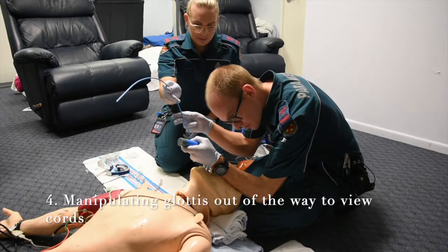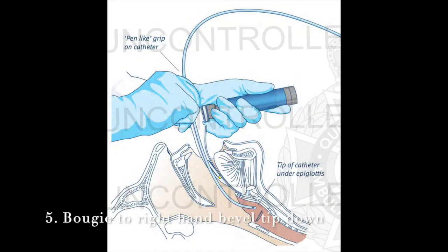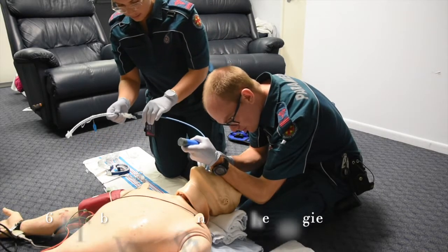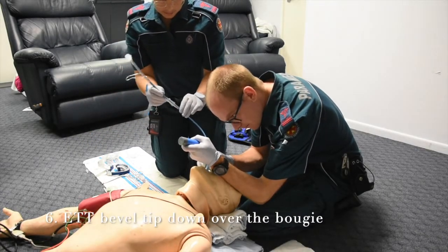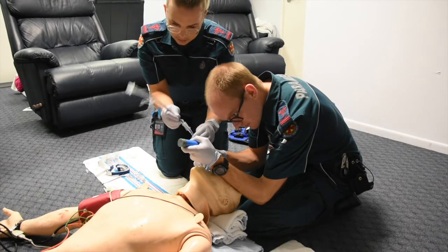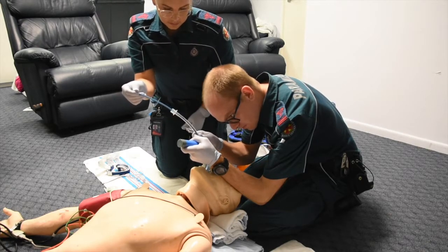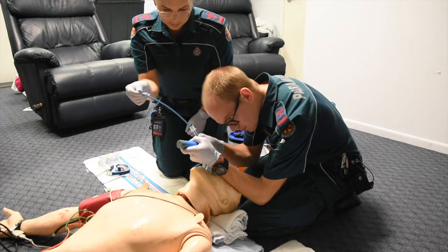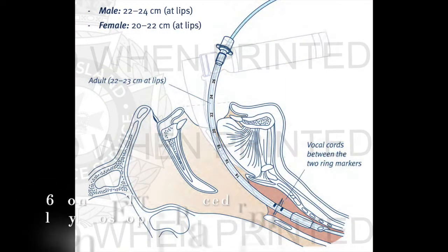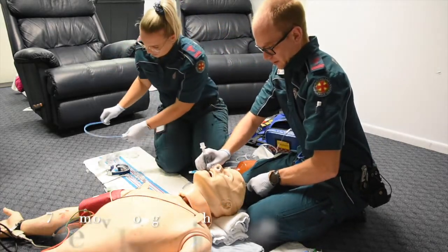Can I please have the bougie with my right hand, bevel tipped down? Okay, the bougie is through the chords. Alright, can I please have the tube over the bougie, please? Holding that in place, watching out for the teeth. If I was to find this difficult, I could always do some laryngeal manipulation. I have the tube, hold the bougie, tube through the chords, and that's 22 at the lips. Okay, remove the bougie for me, please, but be careful of the flick.